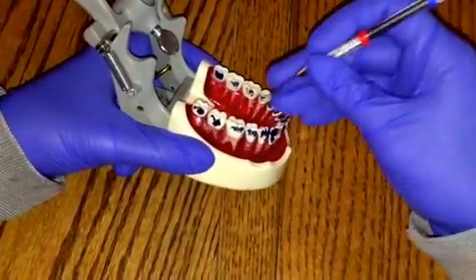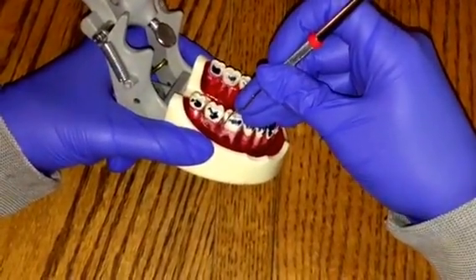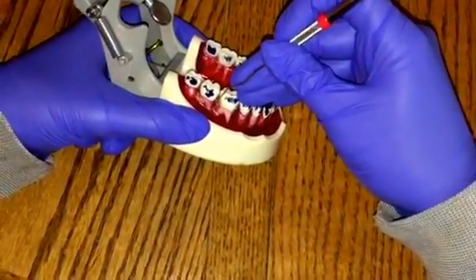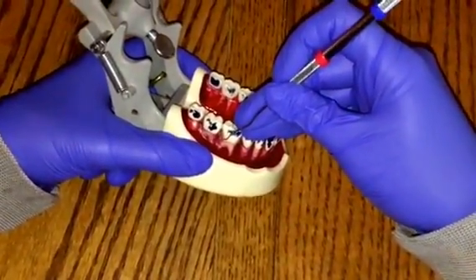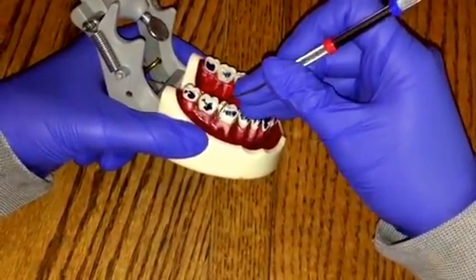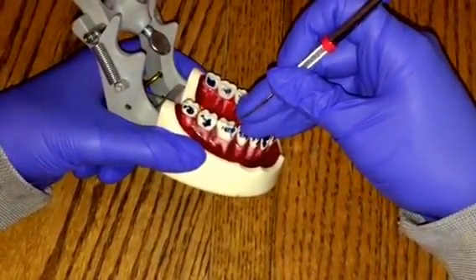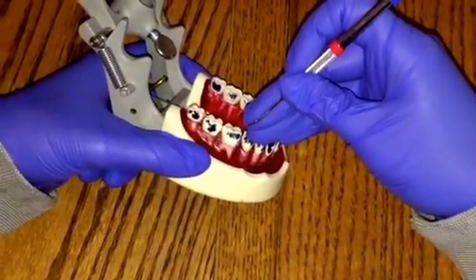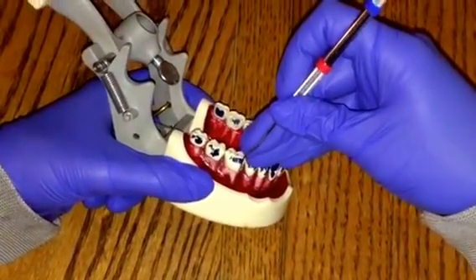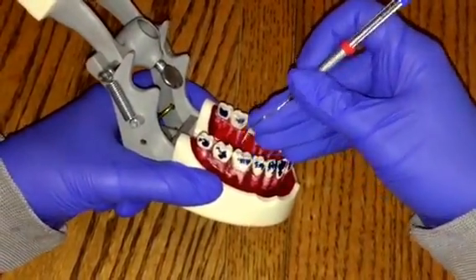So let's go back to that tooth. When you were scaling here, or when you were exploring, you stopped about right here. You need to go all the way into the col and then safely back out. Now back out and demonstrate moving mesially. When you proceed mesially, ensure that you are standing up on your fulcrum and rolling. You did not roll enough and had to do it again, and you could have caused trauma to your patient. So make sure again that you stand up on your fulcrum, move into that mesial, and go all the way into the col and then back out safely.